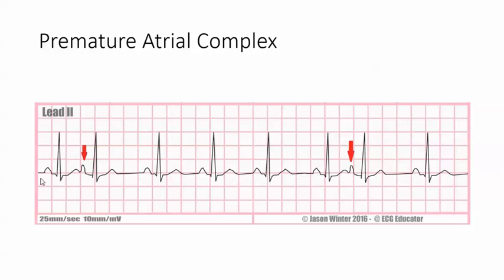This is a sinus rhythm — they have a normal P before the QRS, the PRI is normal, and the QRS is normal. Let's mark the sinus beats: this one, this one, here, here, here, and here.